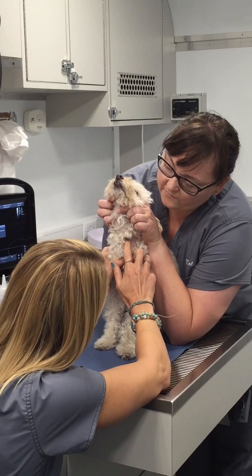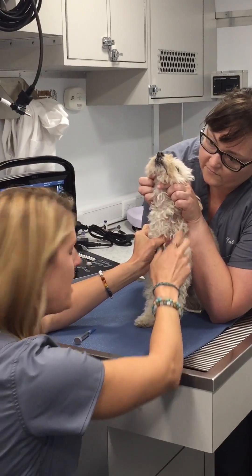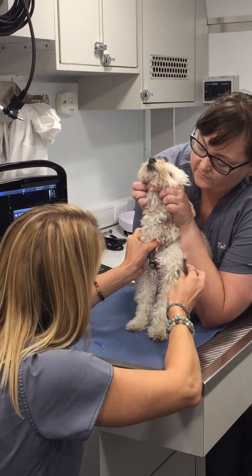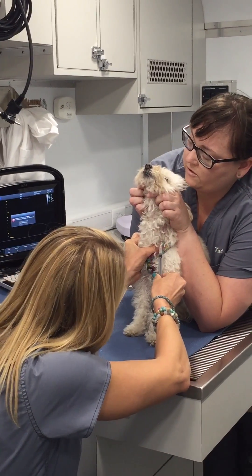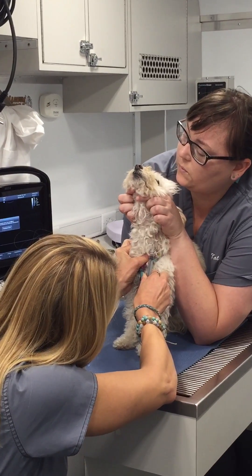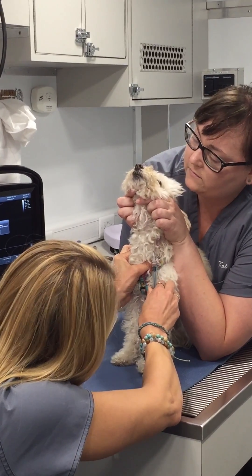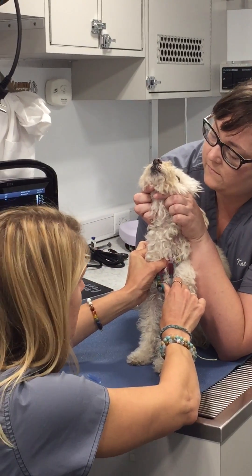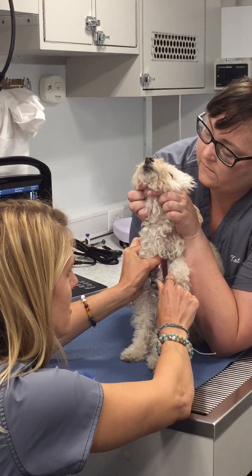We just hold off the vein. Mim coughs a little bit — not all dogs do that, but just because I'm near her throat. Now here we go. We introduce the needle and then we just have to find the vein. And you can see a nice little red flush right there, and we have a nice blood sample.